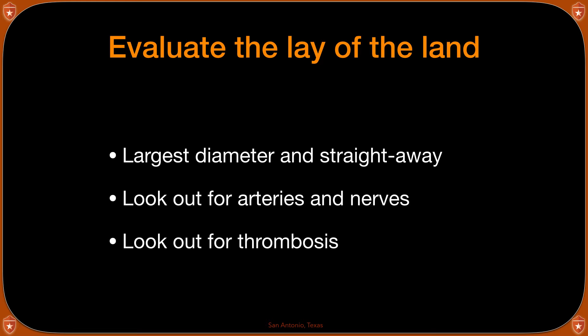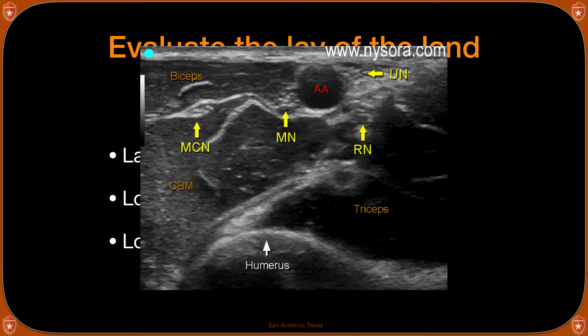Look out for arteries and nerves. Arteries have a thicker wall, are pulsatile, and are not as easily compressible as a vein. Nerves look like little honeycomb structures and oftentimes surround an artery — here you can see the median nerve, radial nerve, and ulnar nerve denoted in yellow. Avoid arteries and nerves to decrease the amount of pain and complications during central line placement.